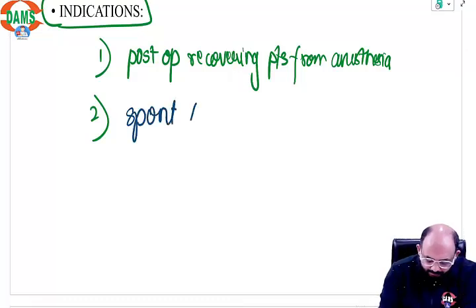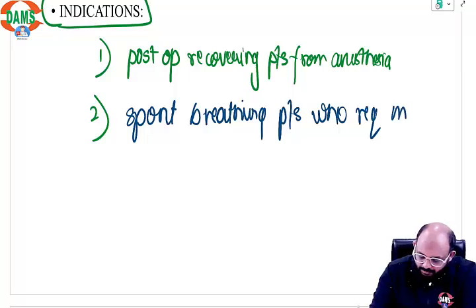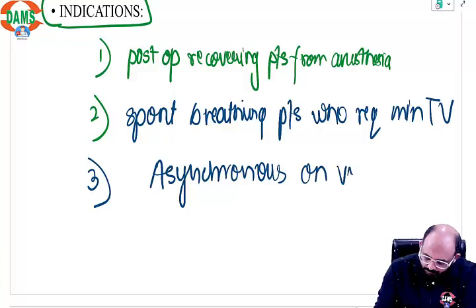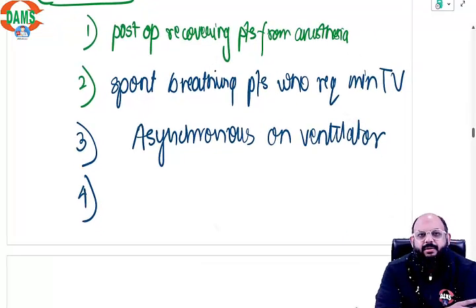Spontaneously breathing patients who require minimum tidal volume. Asynchronous on ventilator: somehow your traditional modes of ventilation are not able to synchronize with the patient's respiratory rate.